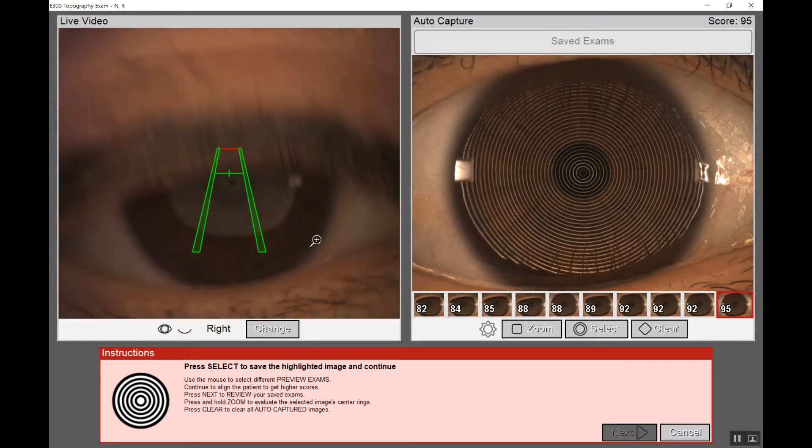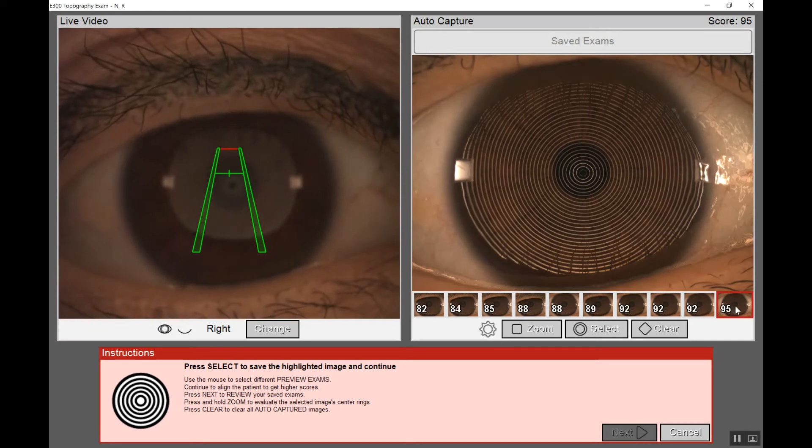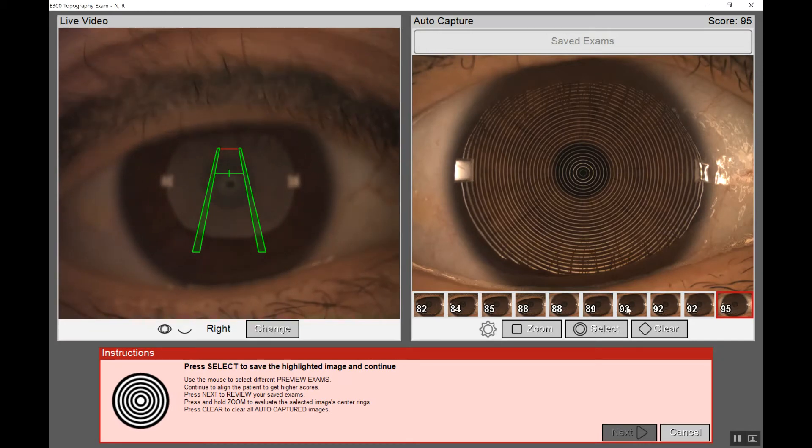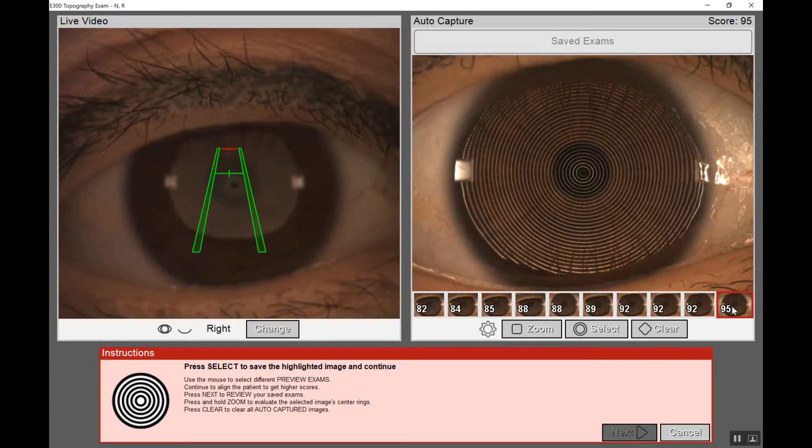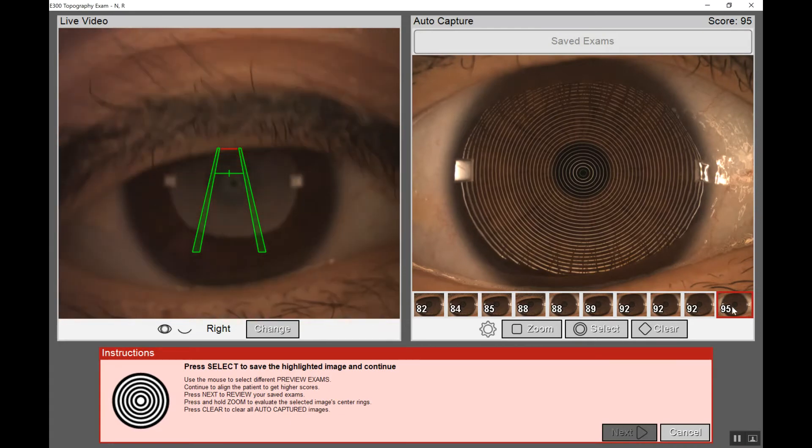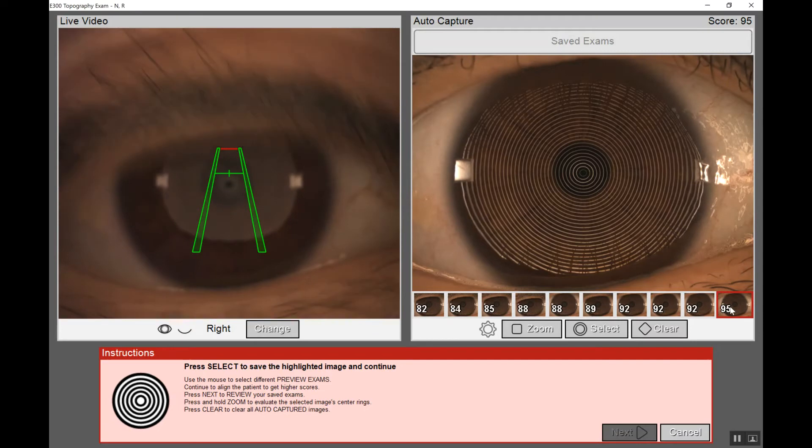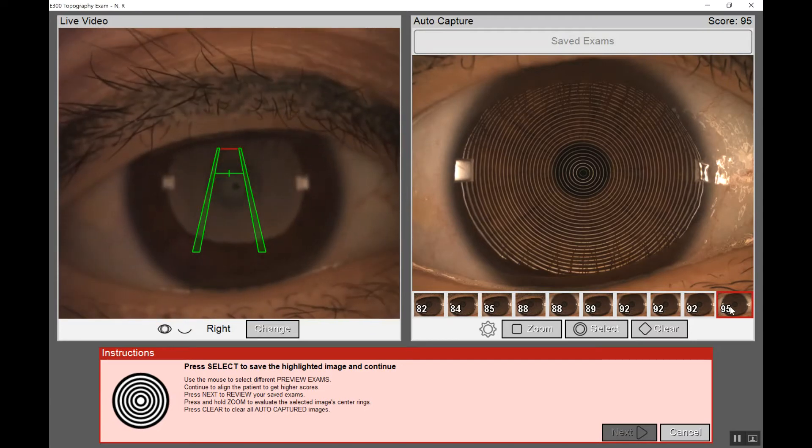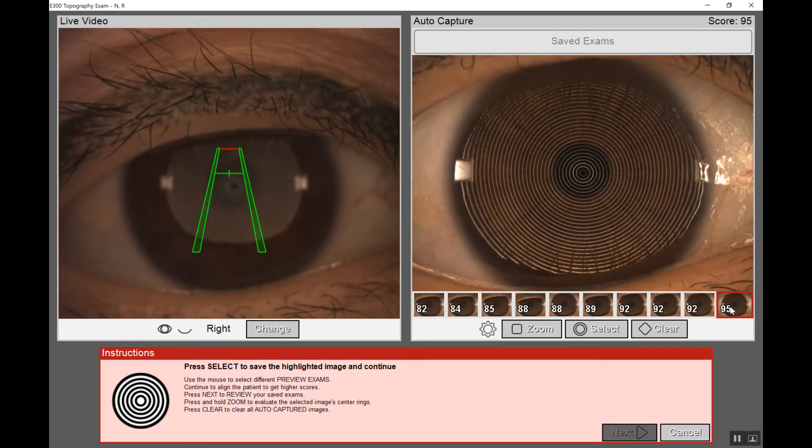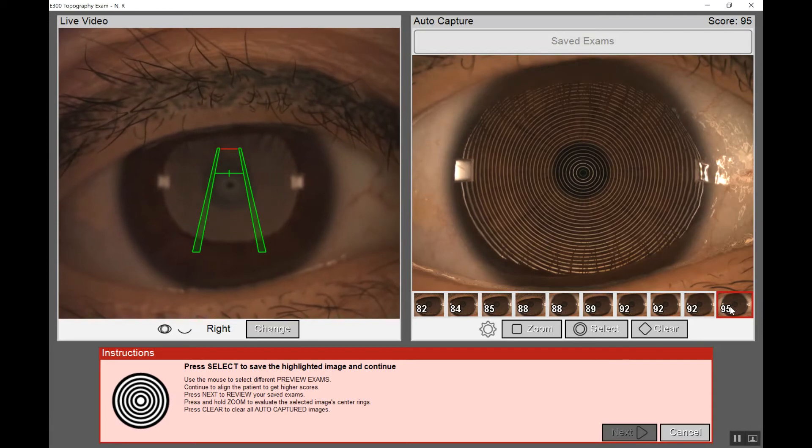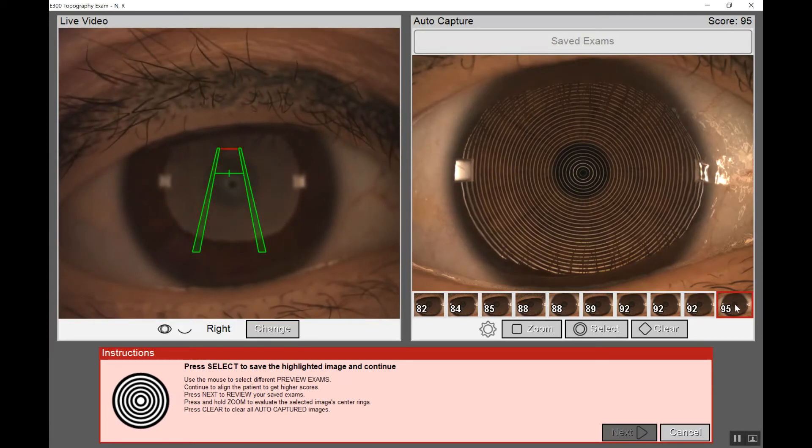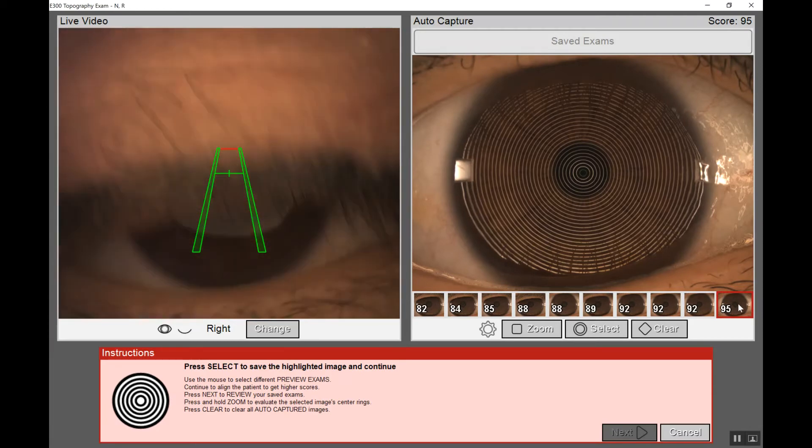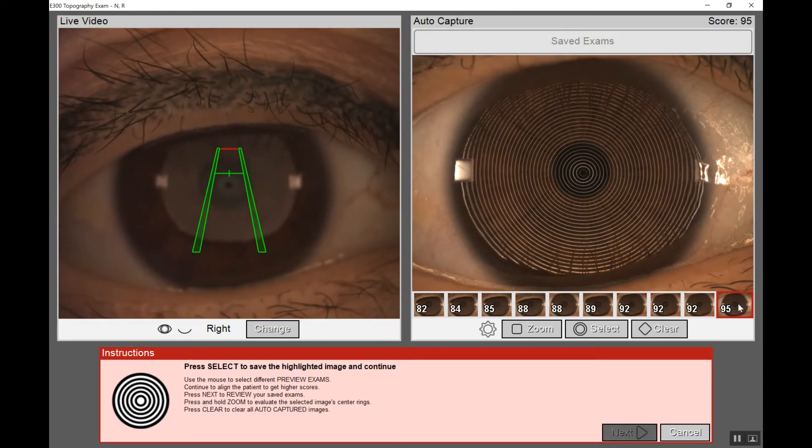Now notice along the right hand side, you have 92, 92, 92 and 95%. Over 90% and we're happy with the capture. Here we can see percentage confidences above 90, 92 to 95. Let's go to the rightmost, the 95%. The rightmost will always be your highest percentage confidence.